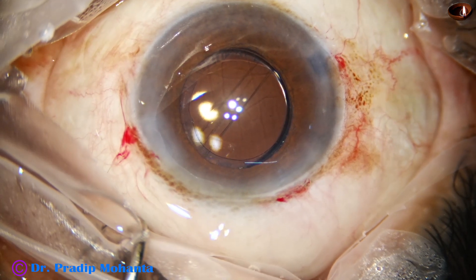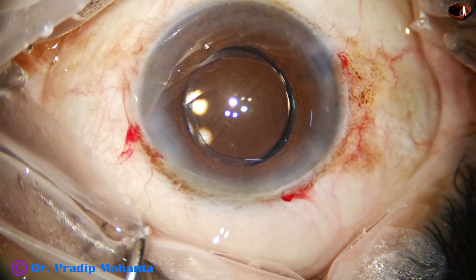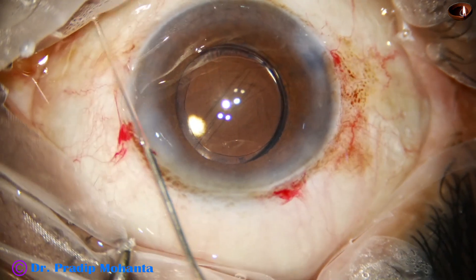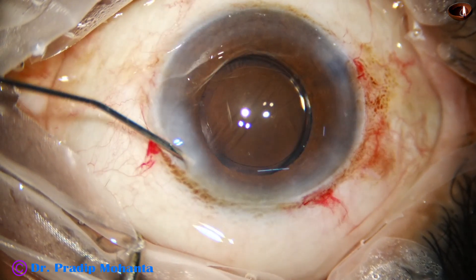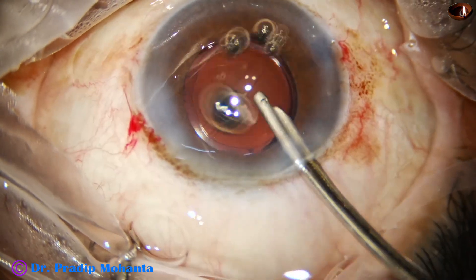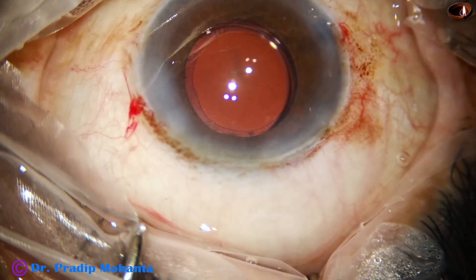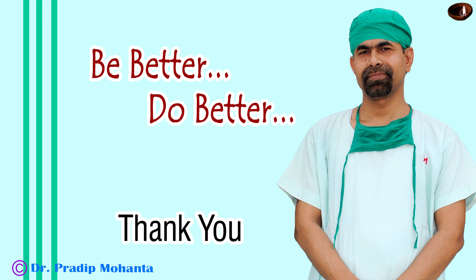Viscoelastic has been cleaned and now a little bit of moxifloxacin is injected. The side ports are then closed by corneal stromal hydration. In this case we have seen anterior insertion of zonule, and my thinking is we should detach its anterior insertion rather than starting the rhexis and tearing it off. This is a unique way of managing anterior insertion of zonule. Thank you very much for your attention — hope this video will help you in developing your surgical skills.